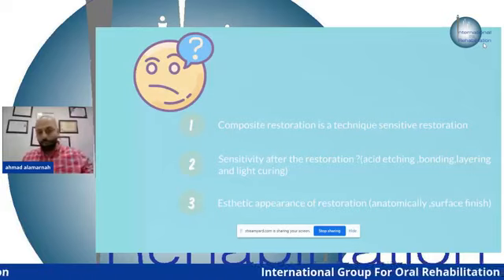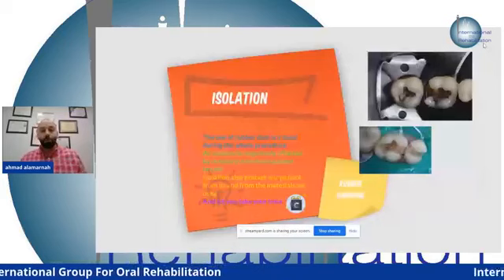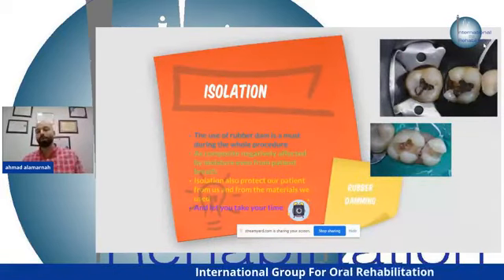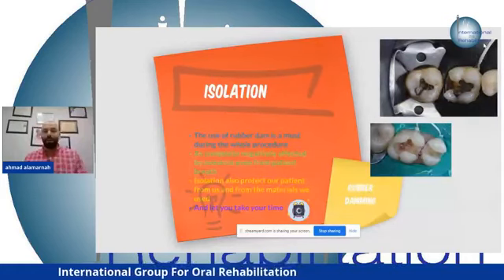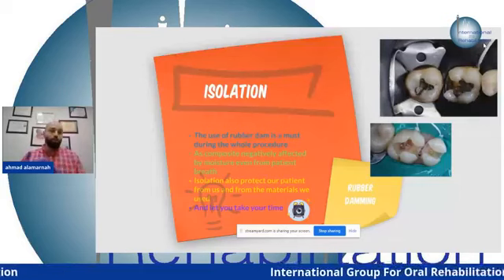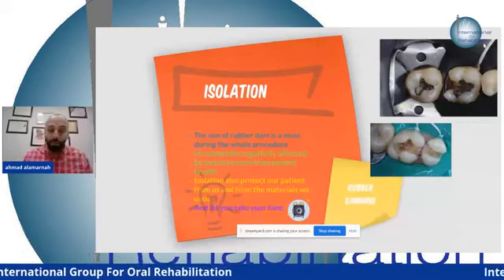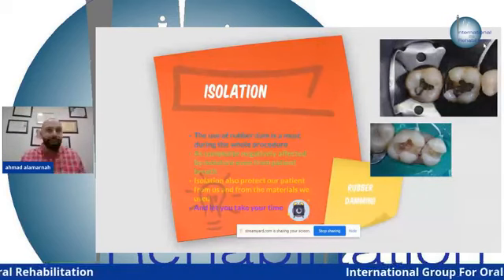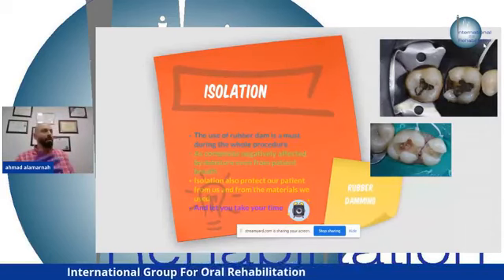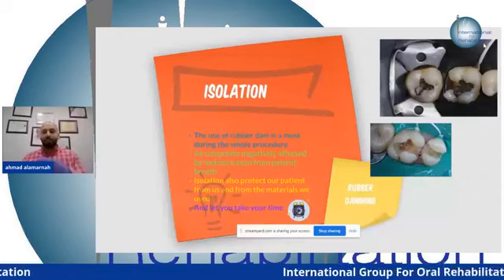So let's talk about the technique sensitivity. Because it's technique sensitive, we must use rubber dam. Rubber dam protects the field that we are working in, gives the dentist the time he needs, gives the patient comfort, and protects him from amalgam debris when we remove amalgam. Let's see the first picture here.